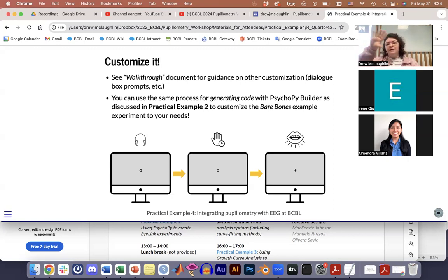But what we did in our tutorials yesterday is we always have the timing of the onset of our stimulus. So if our stimulus for trial 1 started at 2 million, we know that, and we actually renumber from 0. So for our pupillometry data, we have from 0 for the start of each trial. When you go to your EEG system, even if the EEG system initialized on 6 million, which I don't think it does, because we have the triggers sent to the EEG system, we also know the start of the stimulus for the EEG system's timing that has been recorded.